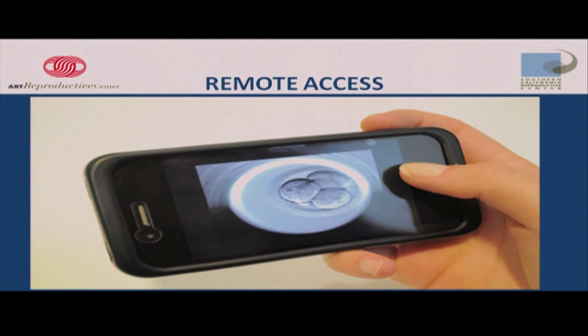So with that, I want to say where we're going with the technology is moving along and advancing quite rapidly. We can now ask for a second opinion from somebody else remotely. On my cell phone, I have patients in it right now. I can go in and look. I'm here in New York, they're growing them in LA, and I can go in and give a good analysis. So the technology is allowing us to not only have more information to analyze and make a decision, but we can do it anywhere, at any time, and have second opinions by people who have the experience and knowledge to make the best decision.